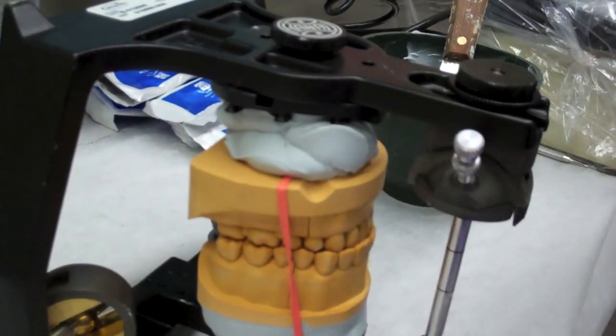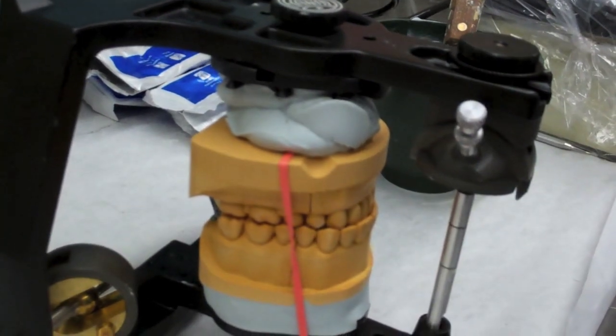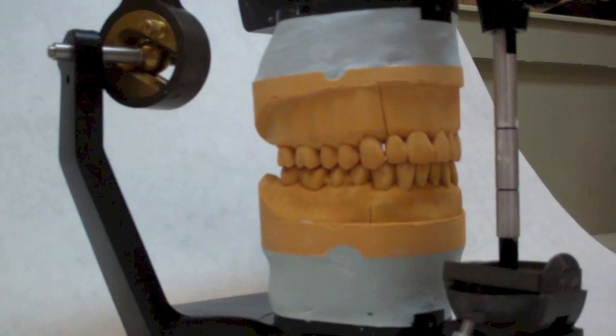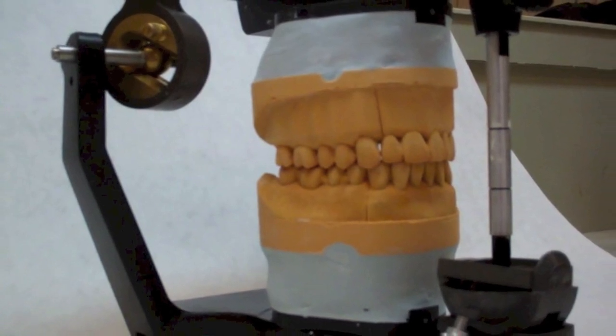Once the stone has set, you will repeat the steps you did with the maxillary, and then clean the articulation. When finished, your articulation should look similar to the one shown.